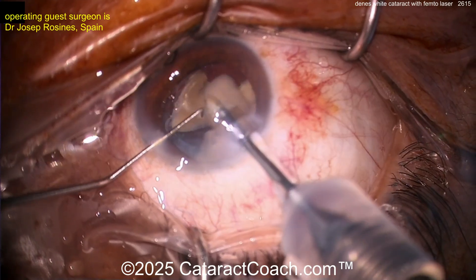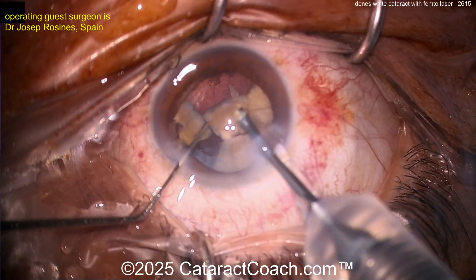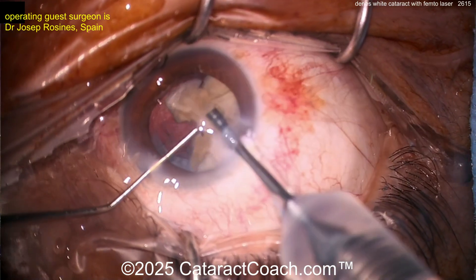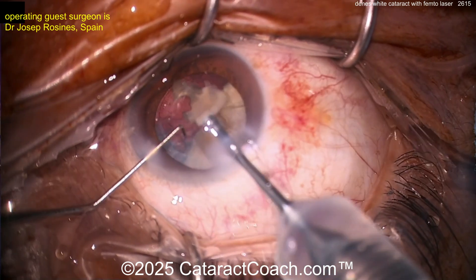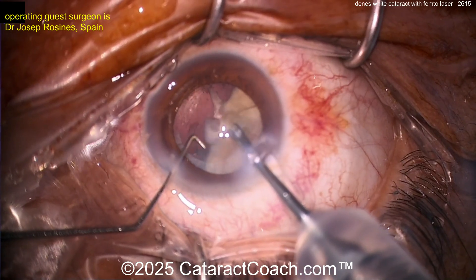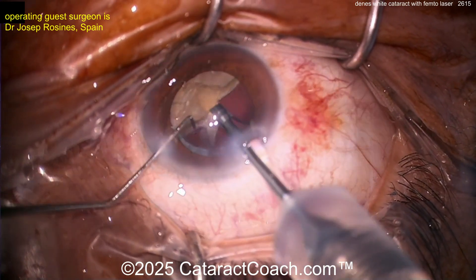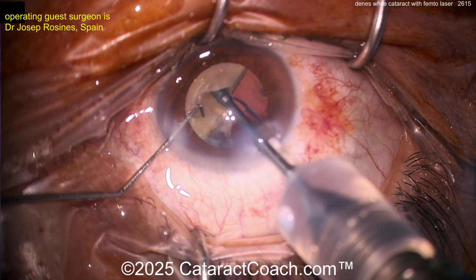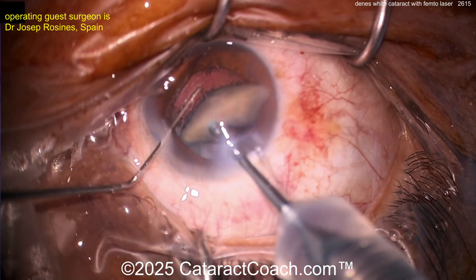There are other devices as well. I encourage you to learn as much as possible, have as many tools as you want in the toolbox, and then figure out which are your favorites and when to use each tool — that's probably the ideal method. Again here, probably because the patient has a big brow it's a little hard to keep the eye in primary position, but able to get these pieces out pretty nicely. This is my favorite in all of medicine — the dense white cataract phaco surgery.